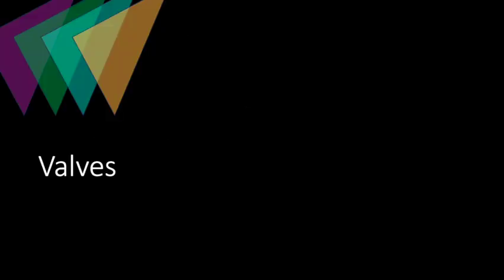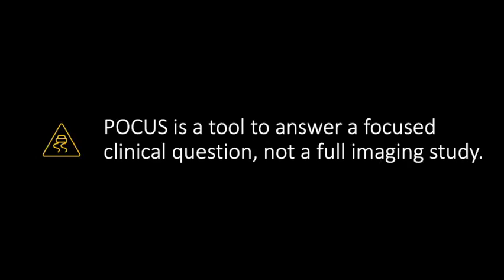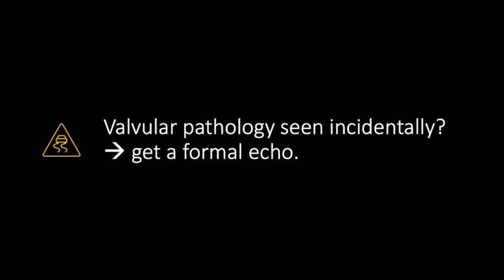Another thing that sometimes we want to look at within the heart is the valves. However, and you thought you were going to get away without this slide, but no, it's going to be in every lecture. Remember that POCUS is a tool to answer a focused clinical question and not a full imaging study. That being said, POCUS is not geared for big valvular pathologies. So if you happen to see valvular pathology incidentally, that's an indication to go ahead and proceed with a formal echo.